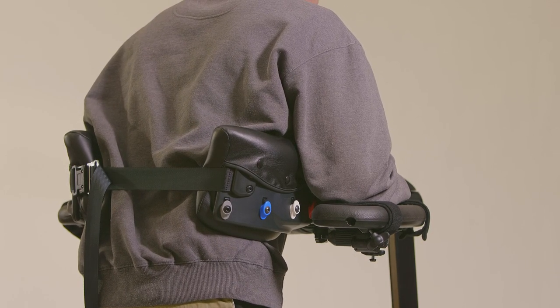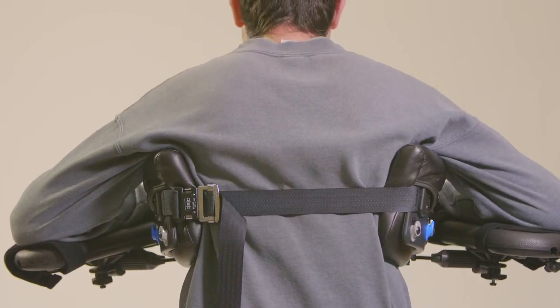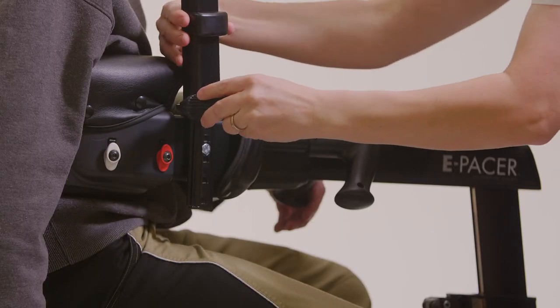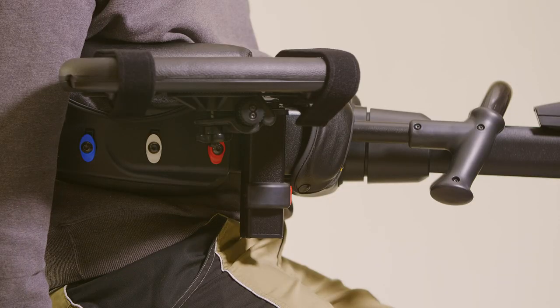If the armrests are too high and the patient's elbows are out to the sides, he might experience shoulder discomfort and difficulty in weight-bearing. You may need to flip the armrest base or move it to the opposite side to achieve the correct position.